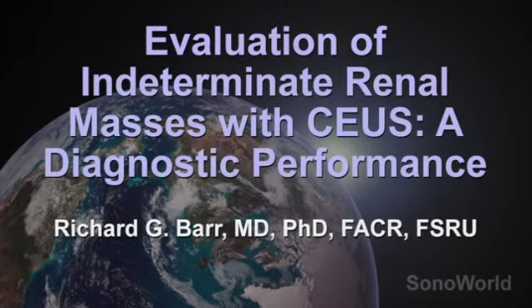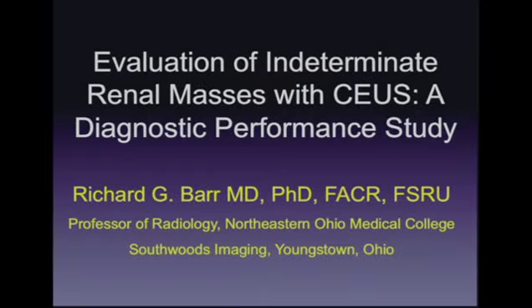Today I'd like to give you a talk on characterization of indeterminate renal masses using contrast-enhanced ultrasound. Today I'd like to review a study that we've done evaluating indeterminate renal masses with contrast-enhanced ultrasound, a diagnostic performance study.